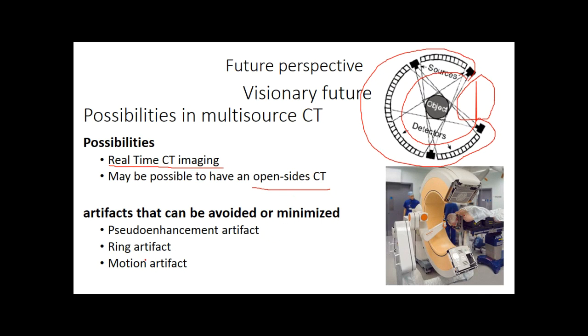The artifacts that can be avoided or minimized, one of them is the pseudo-enhancement artifact, possibly, and ring artifact also, and motion artifact, and other artifacts maybe possibly can be avoided.